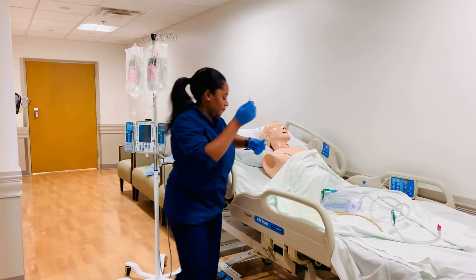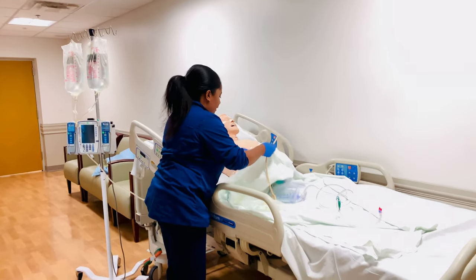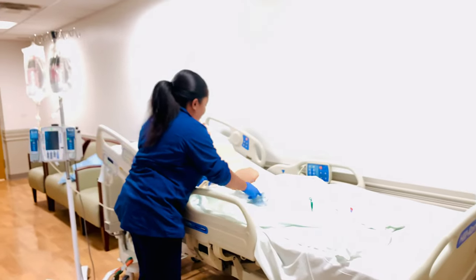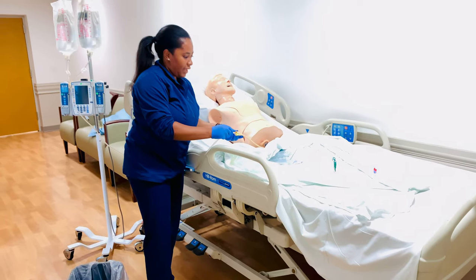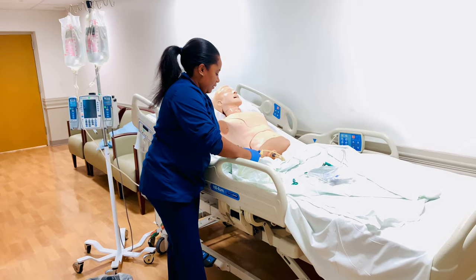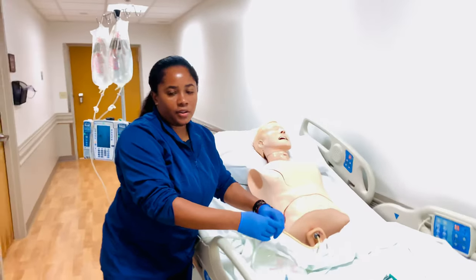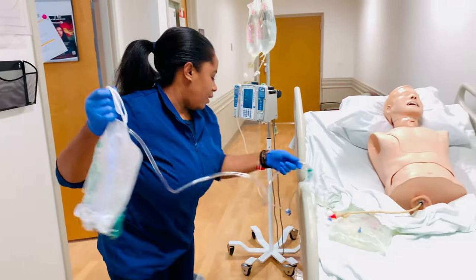This is what the catheter looks like — it would have already been attached to the patient. This is a three-way catheter: this portion goes to the Foley drainage bag, which is typically attached at the center. This port here is for irrigation. And this lumen is always for inflating the balloon to keep the catheter anchored and in place.